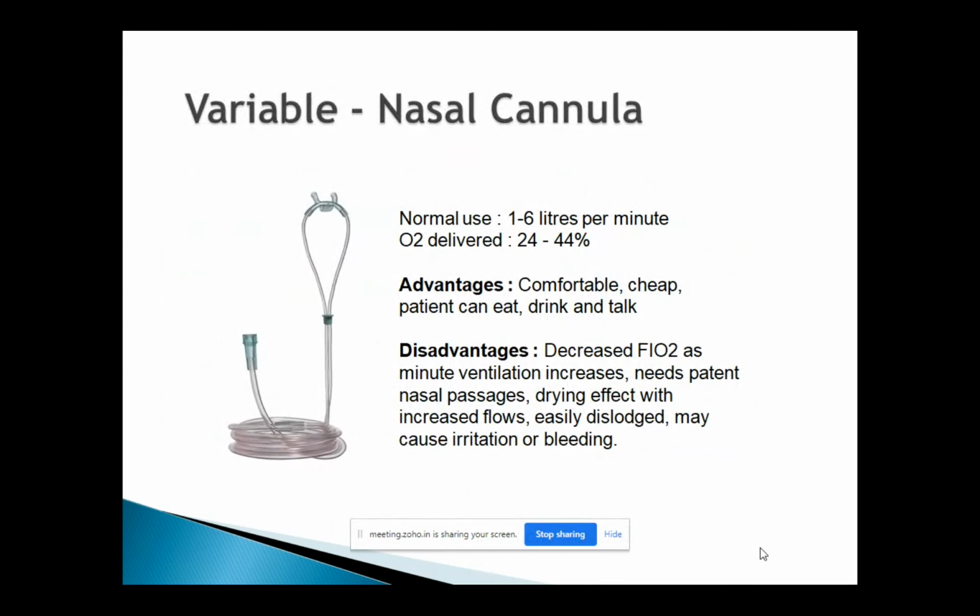Let's go back to this and talk about what common problems happen here. Again, this particular presentation is aimed at adult patients. So we are not talking about pediatrics here, because their lung compliance and lung capacity are completely different. So whatever I'm talking about is suitable for adult patients only.